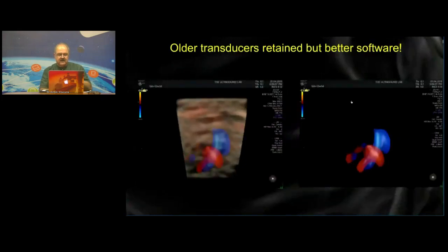I have my controls at the bottom, and in those controls, I can get an outline, which we call a silhouette mode. I can do a 3D acquisition kind of story, as I see here. I blank out my grayscale to the extent possible. I still have some outline, and I get a far better orientation of my inflows, which are still orange, and my outflows, which are still blue, and it's very convincing information.